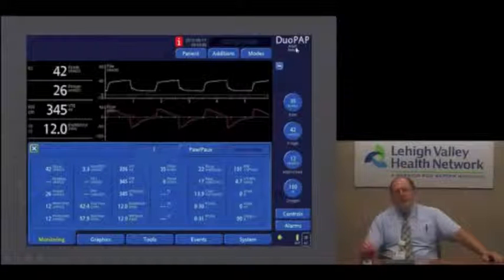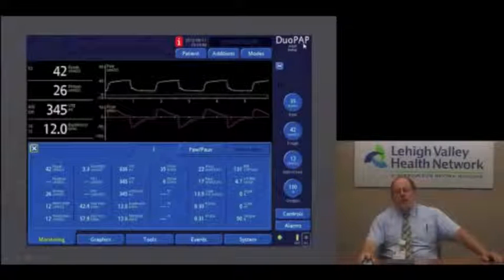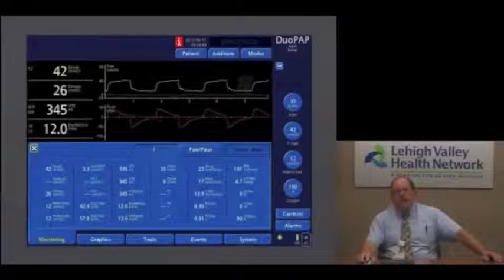So they're both ways of delivering pressure control. This one here just controls the pressure, where the previous one controls all aspects of mechanical ventilation. So for your group, if a patient was really sick and you wanted to pressure ventilate them, I would use the PCMV mode, because that would be the mode that would ensure ventilation better.